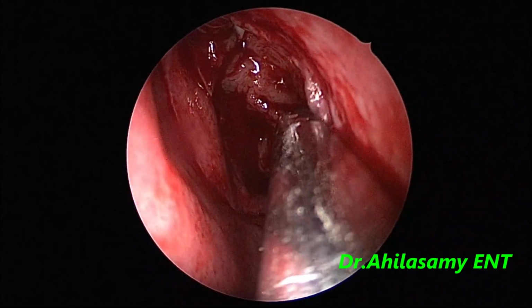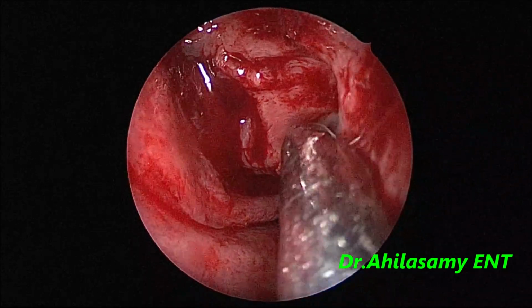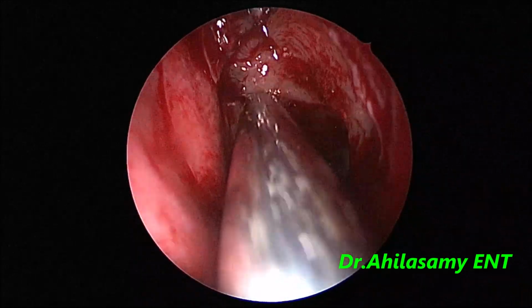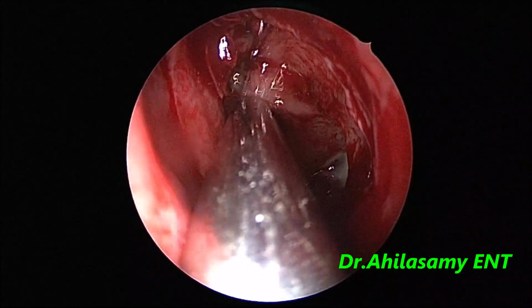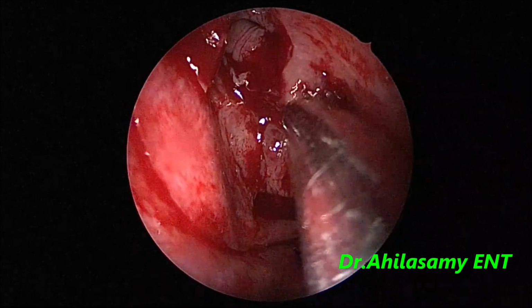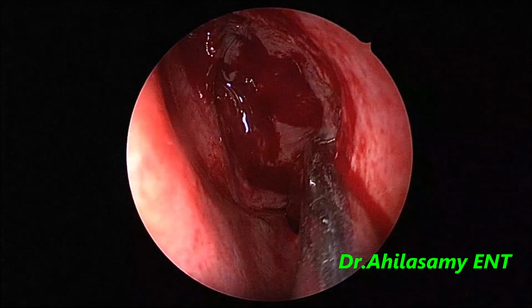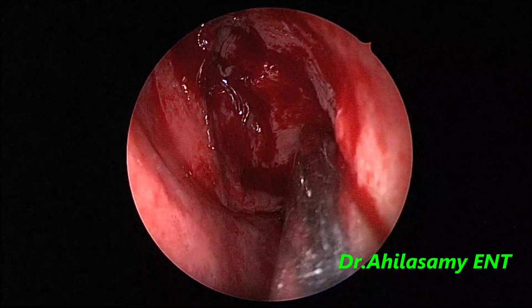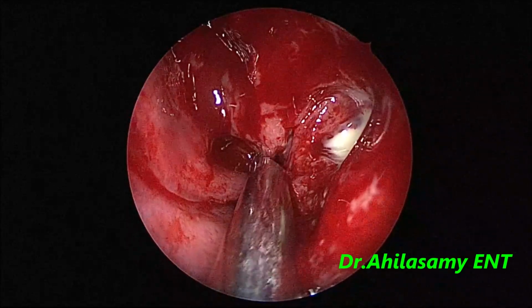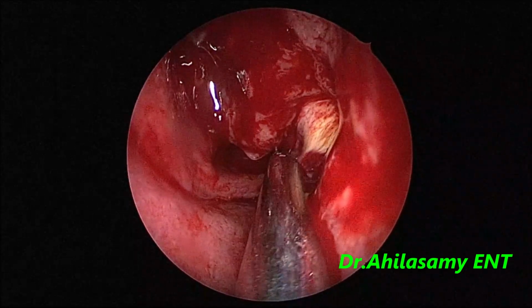Now I am using the shaver to take off the edematous tissues to make the middle meatal antrostomy opening wide. So far I am using only the 0° 4 mm telescope. Now I am taking the ethmoidal bulla also, that means I am doing the anterior ethmoidectomy. There is some gush of bleeding while I am doing the anterior ethmoidectomy. It keeps troubling me throughout the surgery. You can watch a little later how I manage that bleeder.